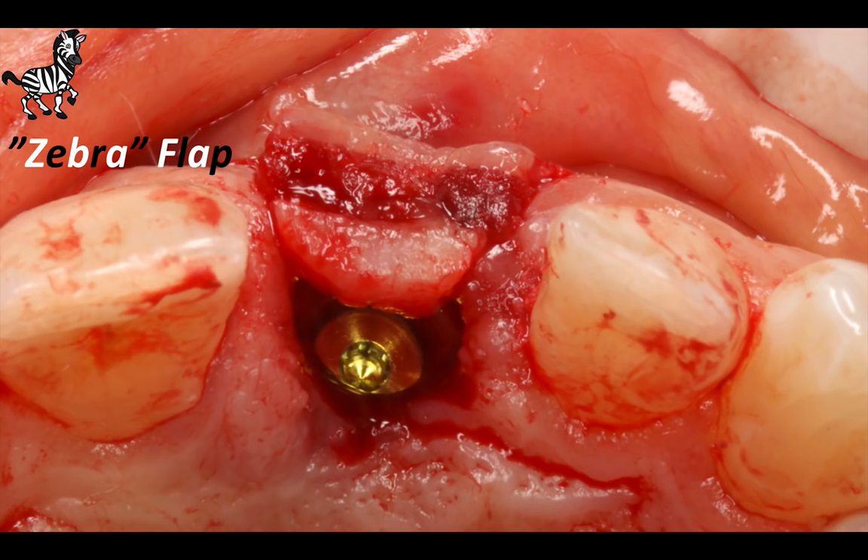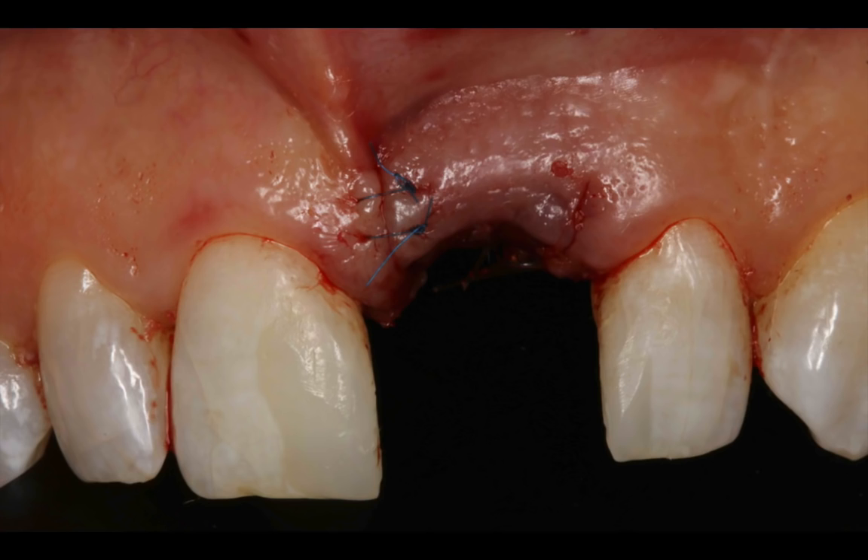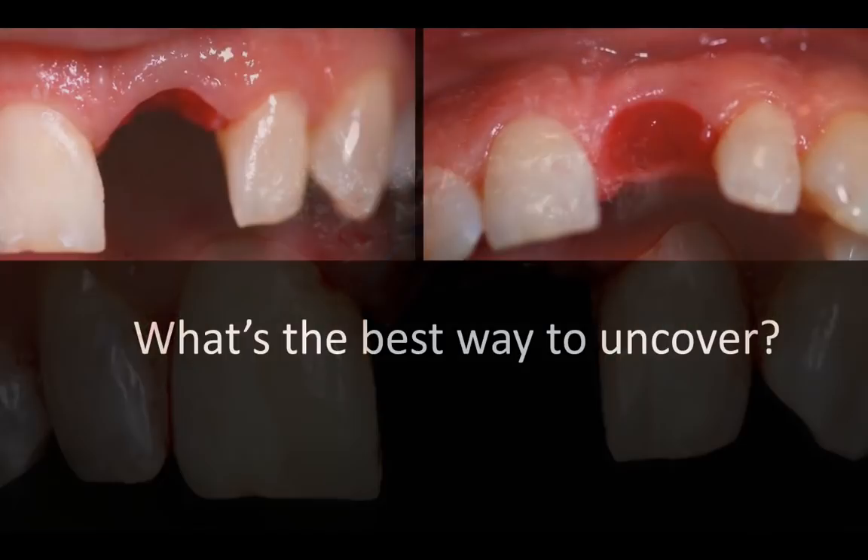The idea was to bypass the poor tissue quality that was on top of the ridge, start with good tissue quality, reflect the flap, place an implant, and then facilitate the suturing and the primary closure. Now because this implant is submerged or placed in a two-stage approach, this patient's dentist, Dr. Glassman, was able to bond the original crown back to the adjacent teeth. And now we are in a holding pattern for several months until the implant integrates and is ready to be uncovered.